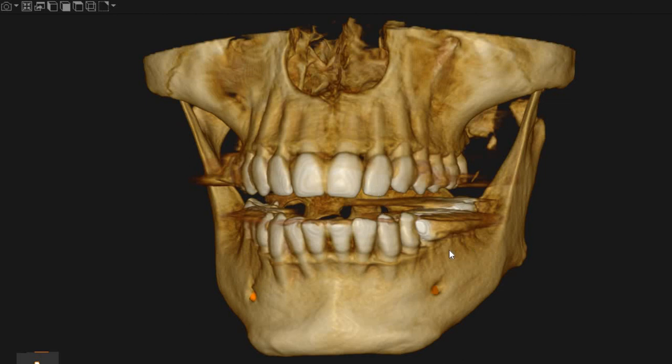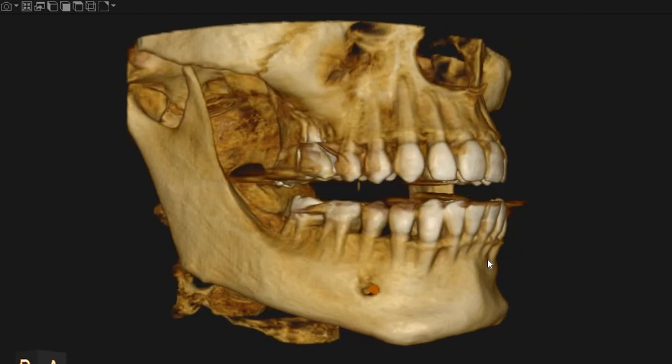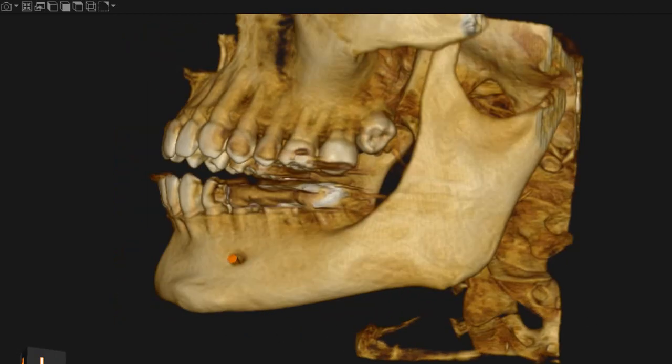Welcome to Ultrascan Diagnostics. This is the CBCT of the patient which you had requested. The area of interest is the lower right 7 and the lower left 6 and 7.